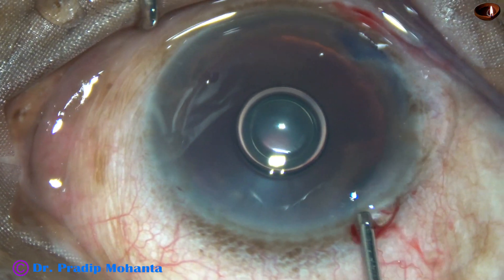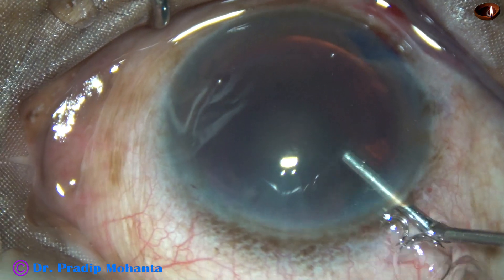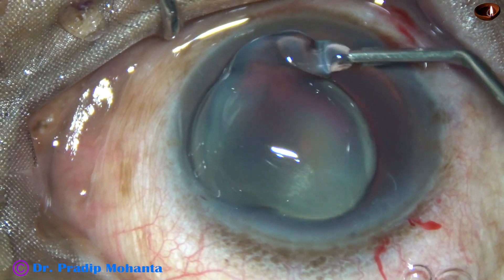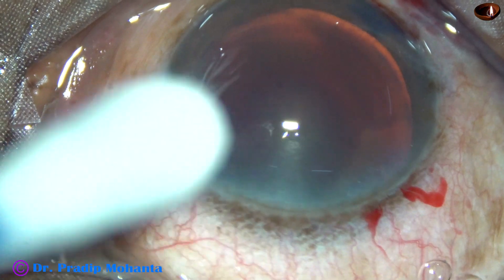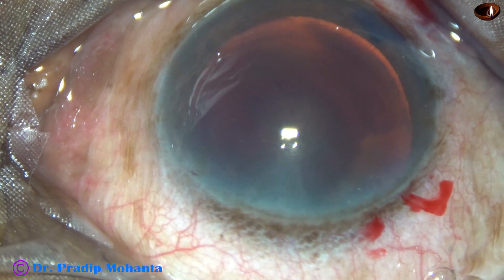So my idea is, if we stain the anterior capsule underneath an air bubble, the staining is very quick. Now the anterior chamber has been filled up with VISCOAT and it has been applied over the corneal epithelium for better visibility. And now I am going to do capsulorhexis.